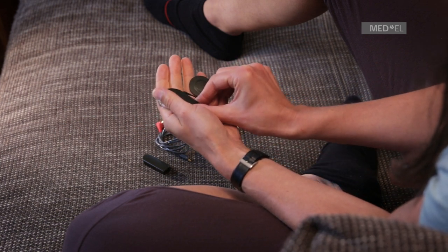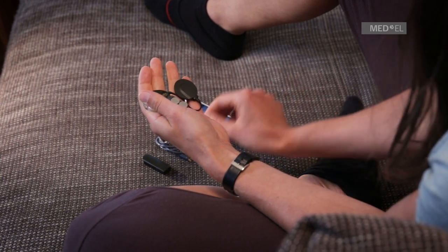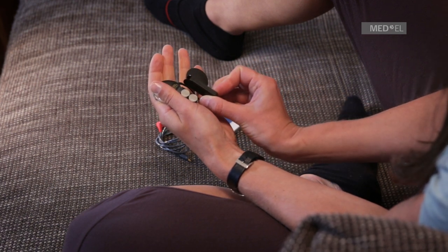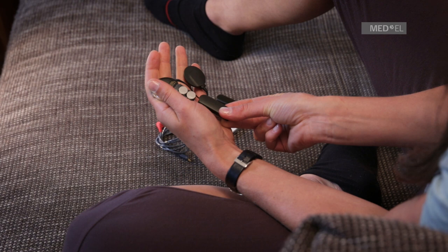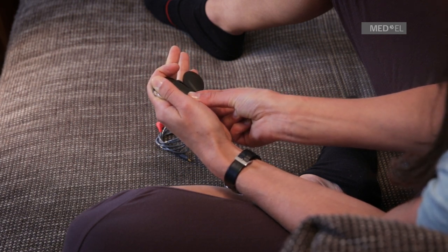Be careful not to use too much force. Slide the FM battery pack cover over the battery pack frame and be careful not to use excessive force. The air inlets of the battery pack cover should be on the same side as the coil cable socket of the control unit.